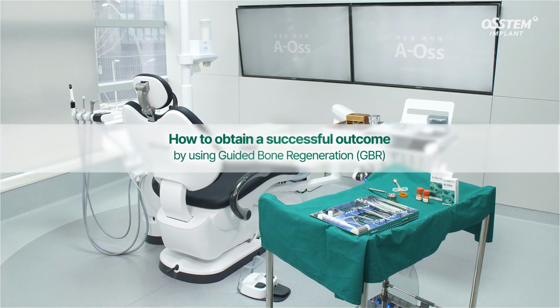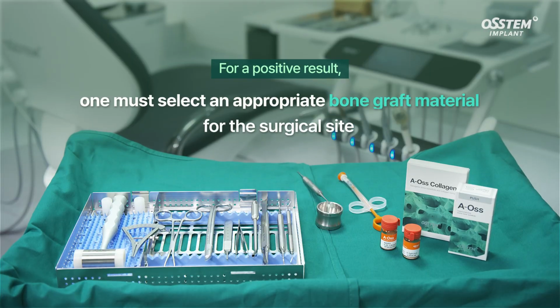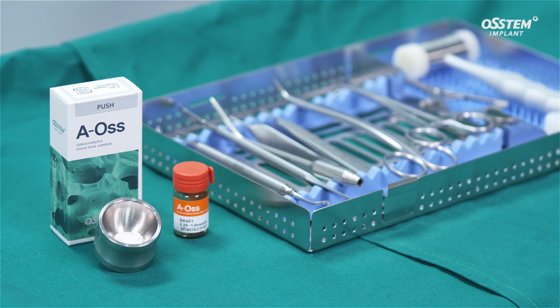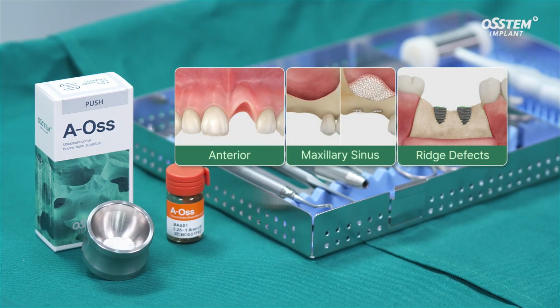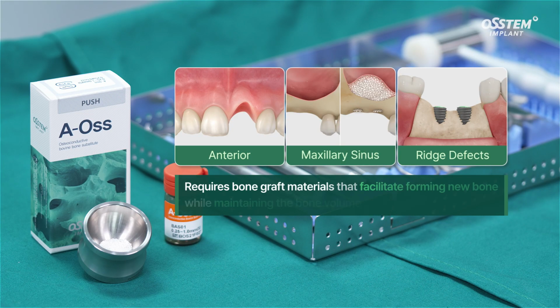Selecting the right bone material by comparing it to the patient's existing bone quality and conditions is crucial when expecting a satisfactory result from the GBR. Defects may occur on surgical sites such as the anterior maxillary sinus and ridge, which will require bone graft materials that facilitate the process of forming new bone (osteogenesis) while maintaining the bone volume.